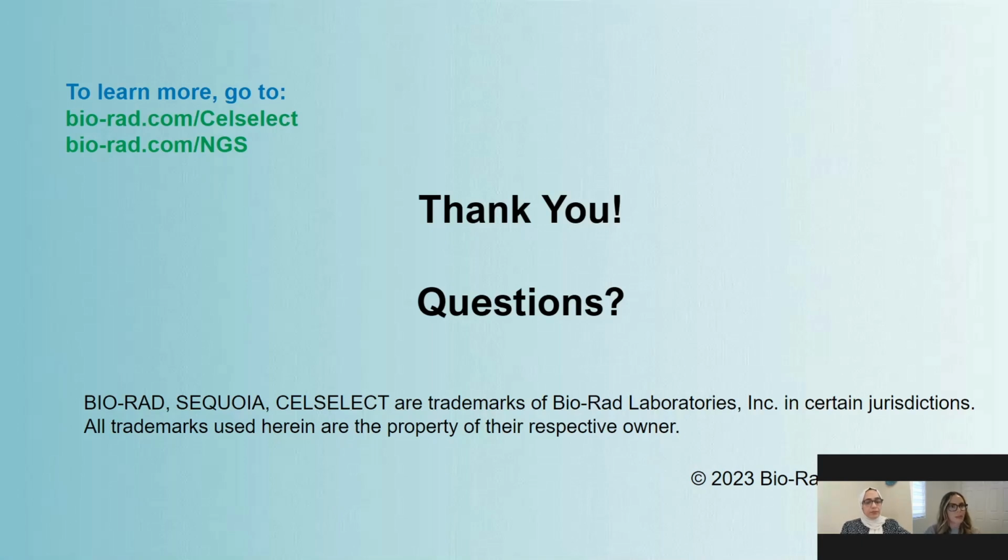Number three, I am interested in doing combined ctDNA and CTC analyses from blood samples. Does the Genesis system have a workflow protocol that supports this? That is a perfect question, and it is aligned to one of my slides that I have shown, working with one of our collaborators. They were processing ctDNA by separating plasma and using that portion for ctDNA, and they didn't know what to do with the leftovers.